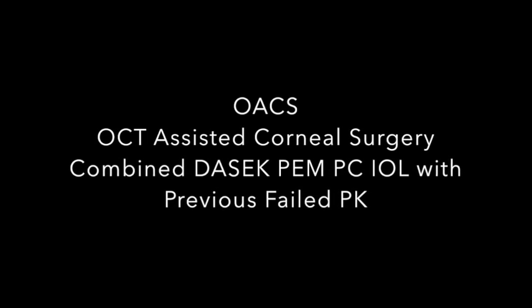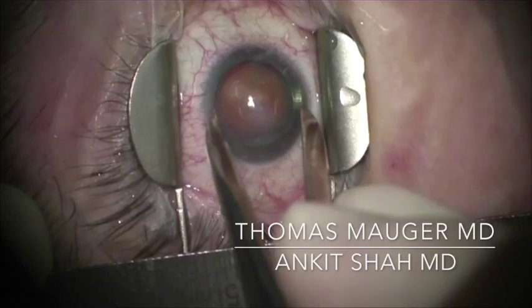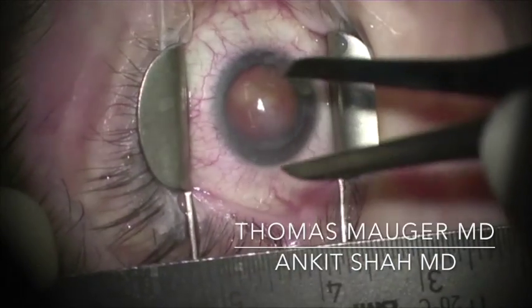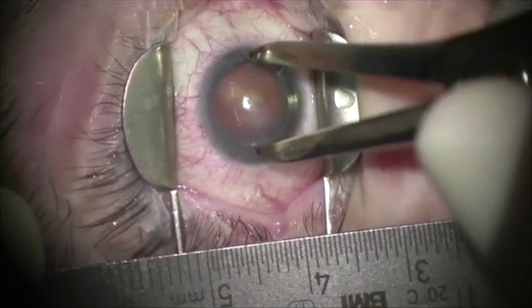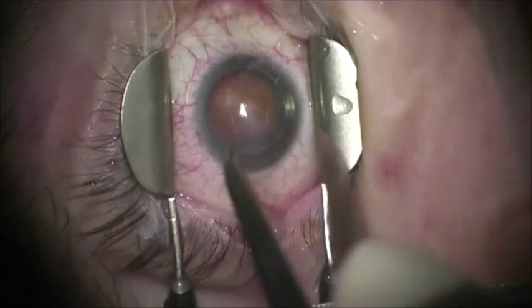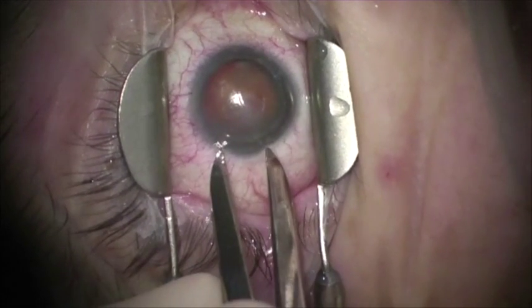Hi, this is Tom Mauger presenting a case of OCT-assisted DSAEK and cataract surgery with lens implant in an eye with a previous PK that had failed. The original PK was done for keratoconus. There is a significant amount of corneal edema and also subepithelial fibrosis that I thought might be a problem.